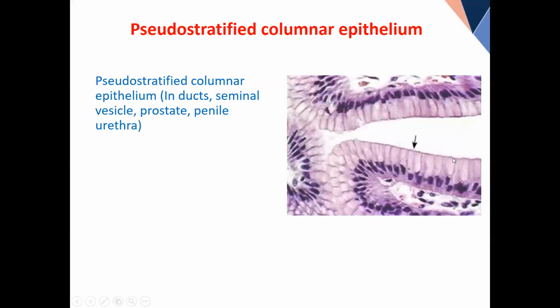You have to start from the lumen. Look at this epithelium. At this point, it gives the wrong impression. But see, there is nothing associated with this. But one thing I'm going to show you, you please remember, and then I'll explain. Can you see this part?